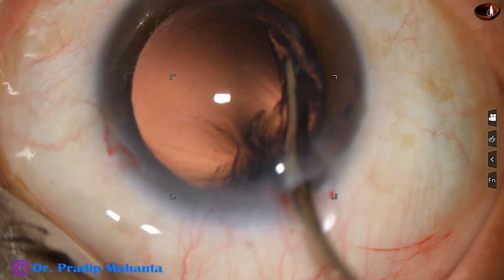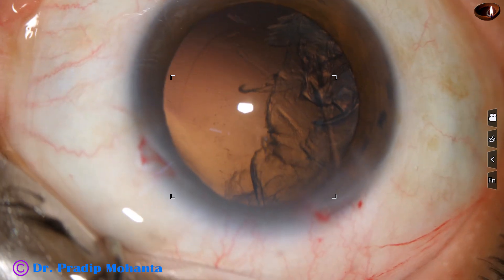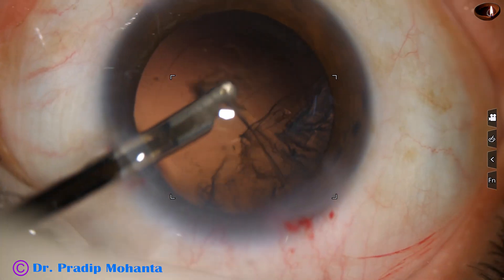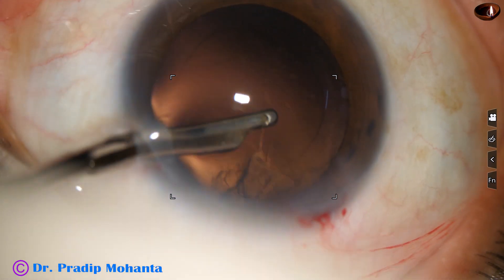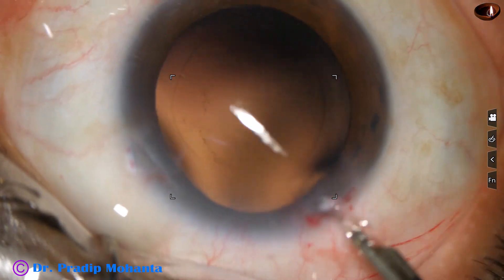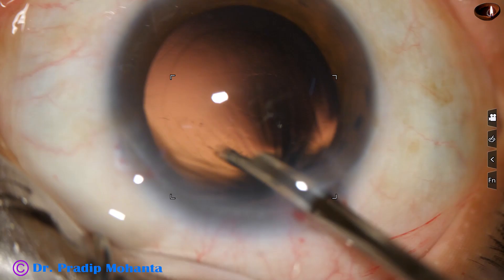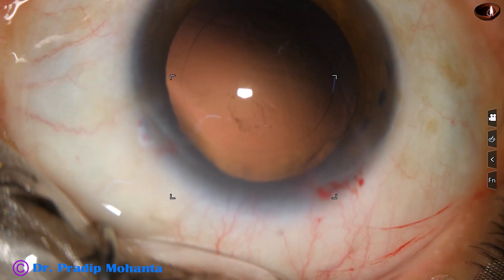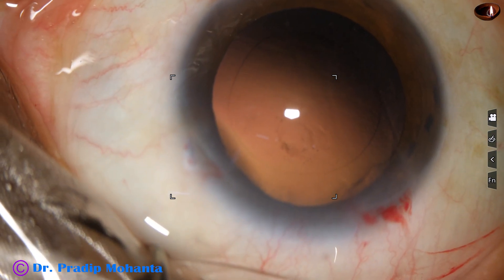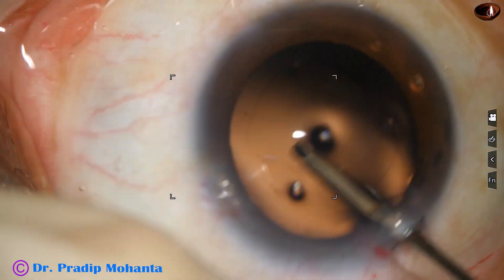We have removed cortex from one o'clock to seven o'clock. Go through this side port. This side port is a little larger than usual — it is about 1.6 to 1.8 millimeters. But you only need one side port to manage such cases. And if a larger side port is three clock hours away from the main incision, astigmatism induced by the main incision is neutralized to some extent by the side port, if the side port is large and 90 degrees away.